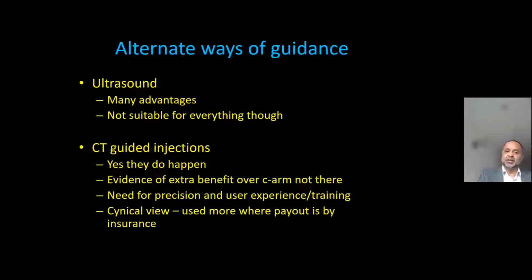Then I am going to talk a little bit about alternate ways of guidance. Ultrasound has many advantages. Although you cannot use it for everything, if you can do a procedure under ultrasound, it is not just the radiation, but also ultrasounds are very portable. They're really small machines, which means that you will be able to do many procedures without needing to come to theater.